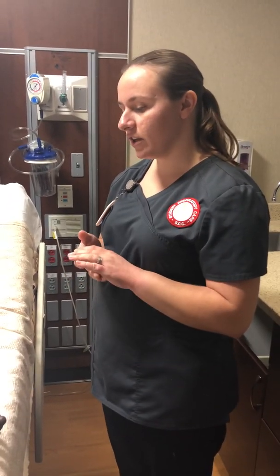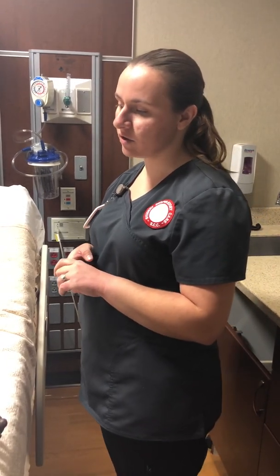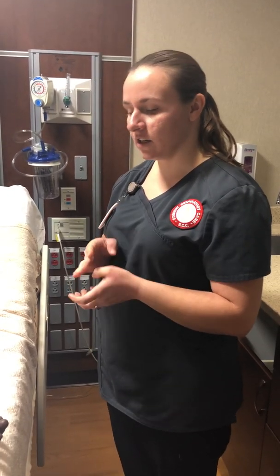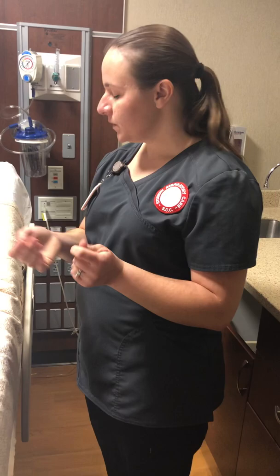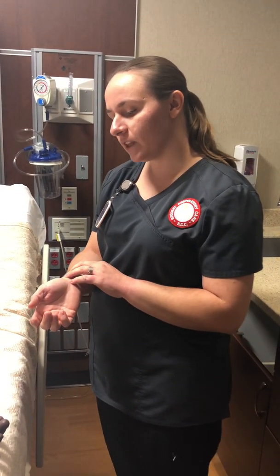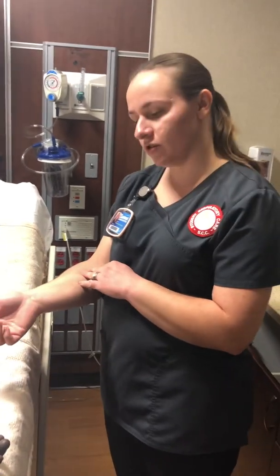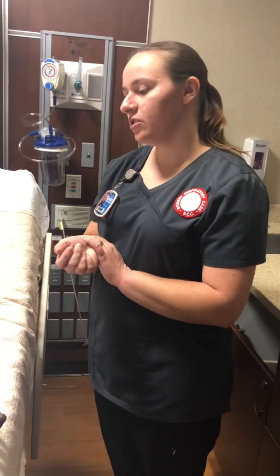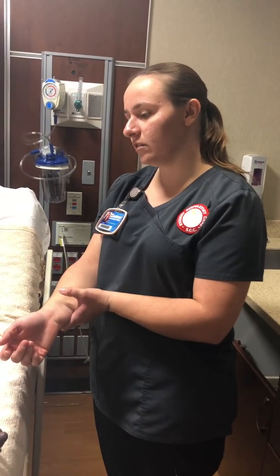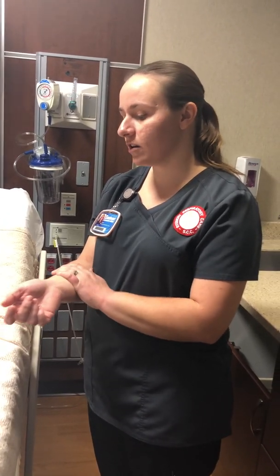Once that is all done, I need to explain to the patient what I will be doing. Today I'm going to draw an ABG. That's just to see how much oxygen is in your blood, to make sure you're getting enough oxygen and that it is not causing any of your problems today, okay? I'm going to draw it from your radial artery, and it's going to be a little more painful than your normal blood draw. I need you to be very still. If you move, I can puncture something else, and I don't want to do that because it can harm you and it can also harm me.